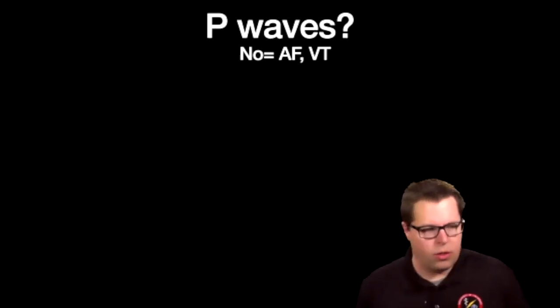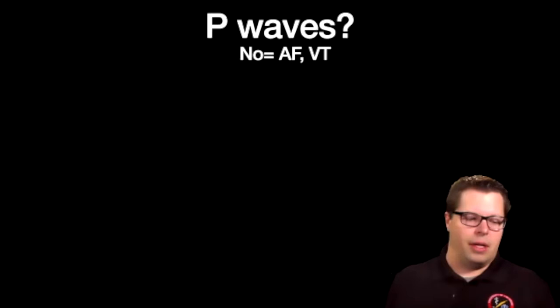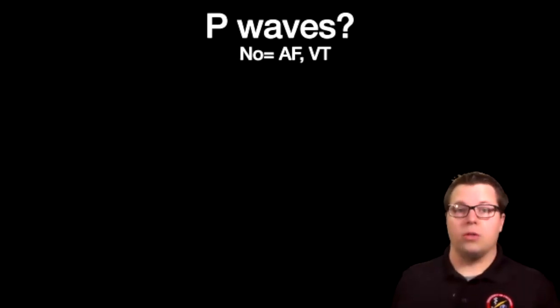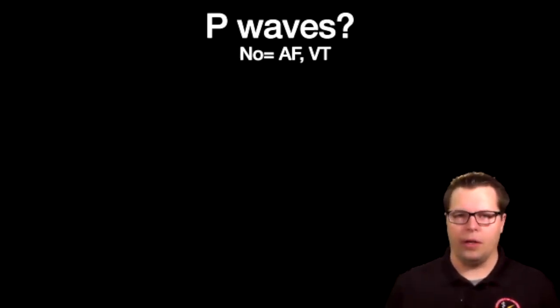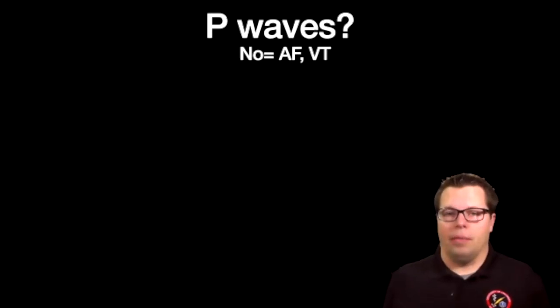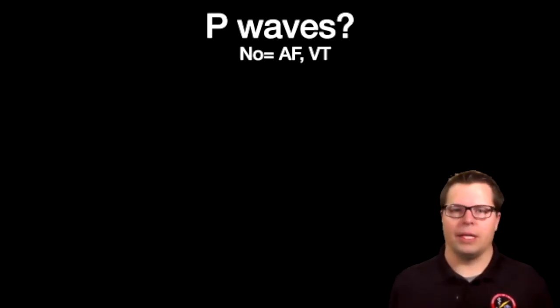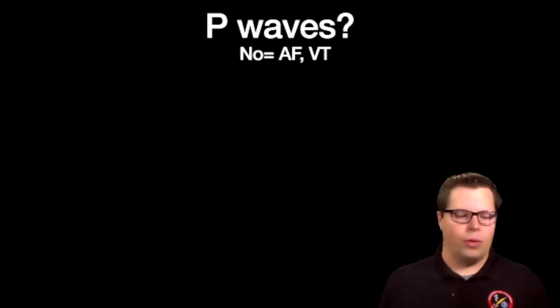The questions when you're determining rhythm, number one, are there P waves? And then you can make some assumptions from it. If there are no P waves, well, then there's basically two things this is. It's either AFib, maybe a flutter, although a flutter probably has P waves, they're just funny looking, or VT. So there are no P waves, it's AFib or it's VT, or it could be, I suppose, complete SA node standstill, but those are the ones you're commonly going to see.